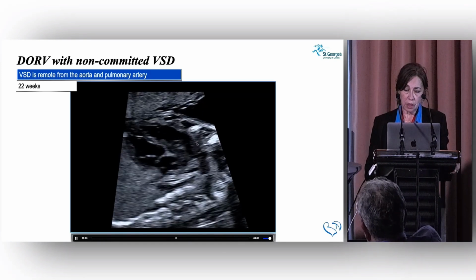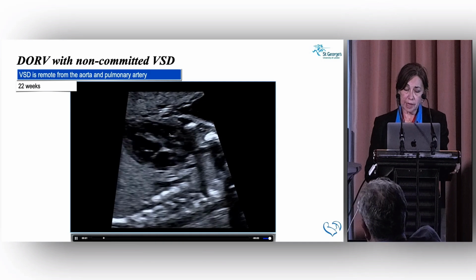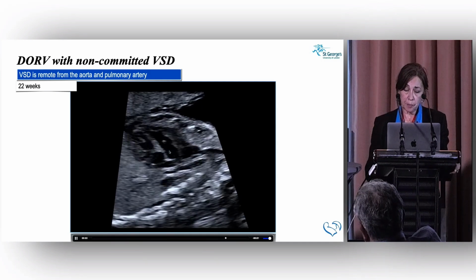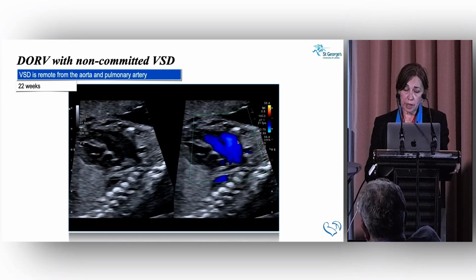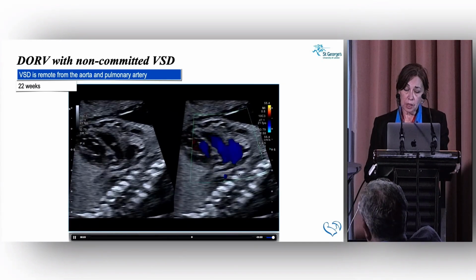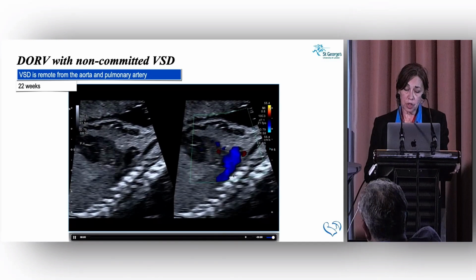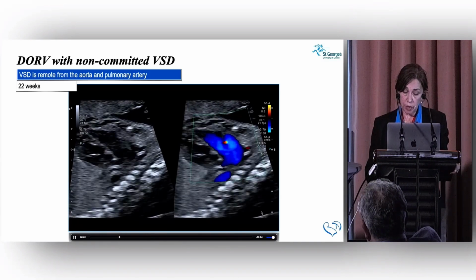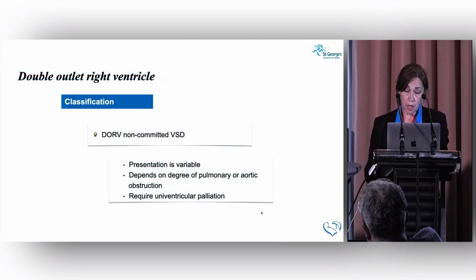Take it back. It's not normally related. They are not side by side. That's the aorta anteriorly and the pulmonary artery posteriorly. So if we look at the sagittal views, we have the vessels in parallel with no obstruction to the aorta. So parallel relationship, not normally related, as I initially said.